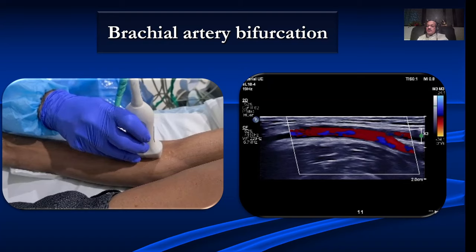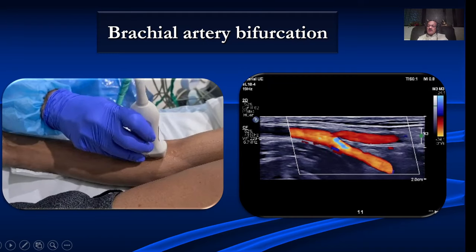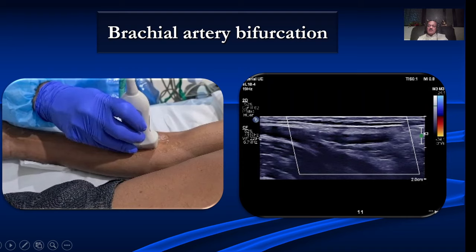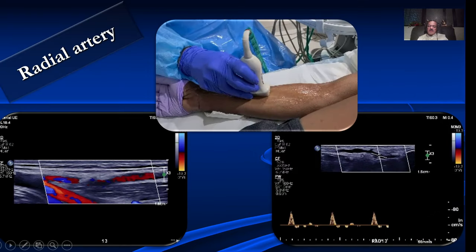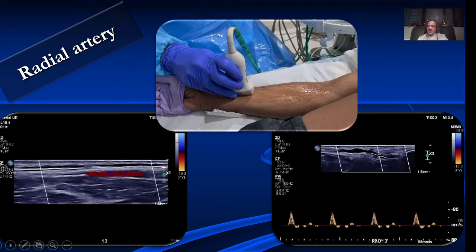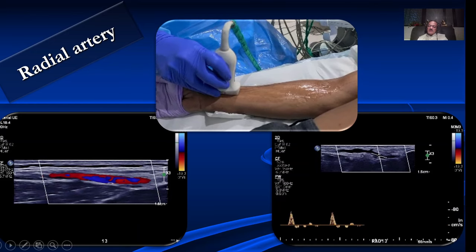It is very important to look at the brachial artery bifurcation — the radial artery goes superficially and the ulnar artery goes down. We then trace the entire radial artery from its origin. It is easy to evaluate because it is superficial. As you go distally, we see a high resistance waveform — particularly in elderly patients, we typically get a very high resistance waveform in the radial artery.